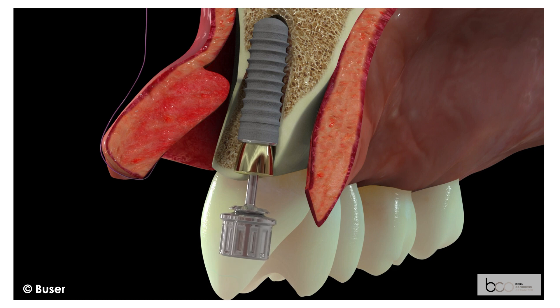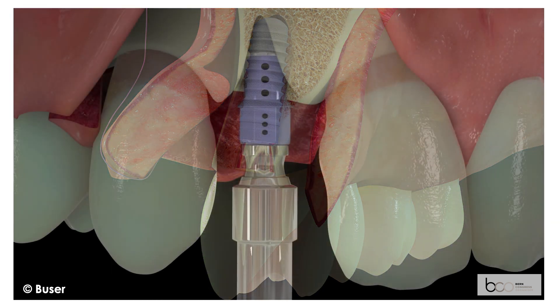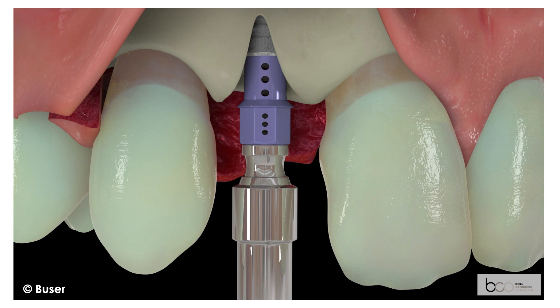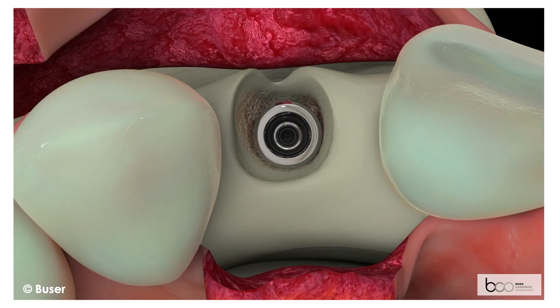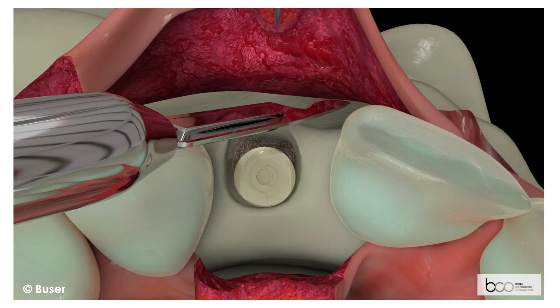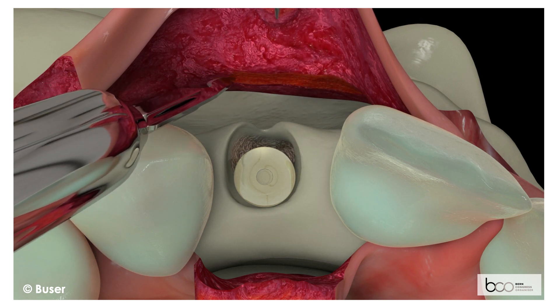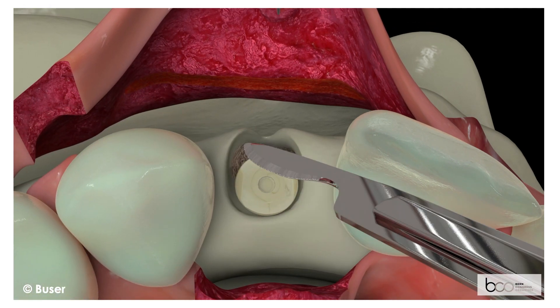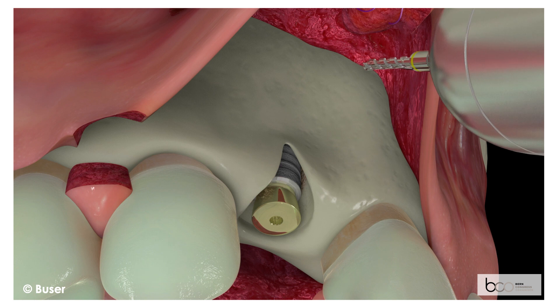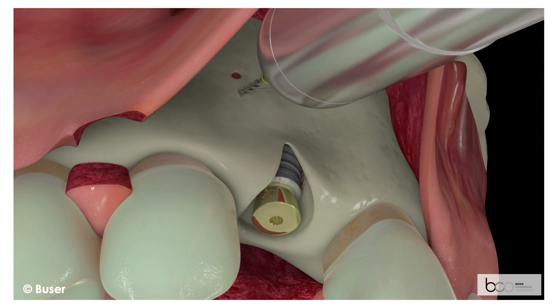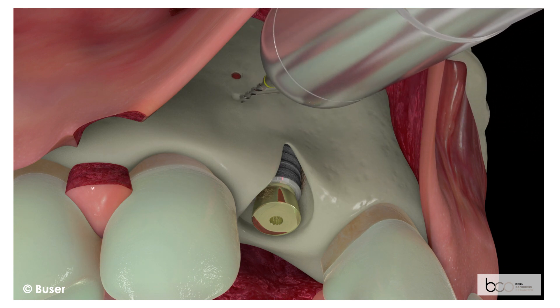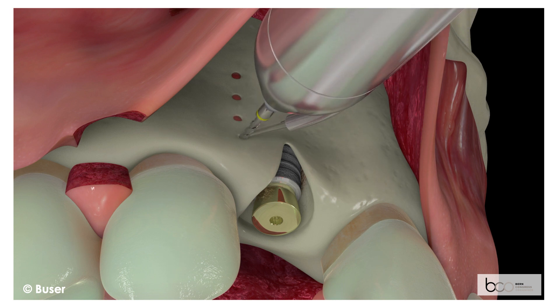Depending on the local anatomy, a healing cap of 2 mm is inserted. The frontal view shows the correct positioning in the coronal-apical direction, with the implant shoulder roughly 3 mm apical to the mucosal margin of the future implant crown. The occlusal view shows the implant shoulder positioned about 1 mm towards the palate. The exposed implant shoulder is inside the bone, resulting in a two-wall defect on the facial aspect. An incision of the periosteum is done to mobilize the flap for tension-free wound closure, and small boreholes are applied in the cortical bone surface to open the marrow cavity and allow some bleeding on the facial aspect.